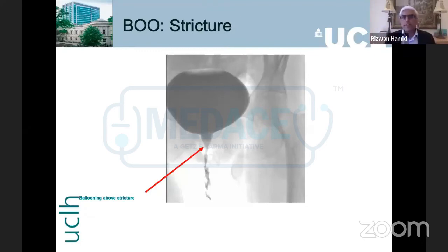So I completely agree, every patient who walks through a functional urology or urogynecology clinic does not need video urodynamic studies. But when the history suggests it, or they've got a history of previous surgery, of the 100 cases we see, that is less than 10%, those are the patients who need these, what we call complex investigations, and probably video will be one of them.